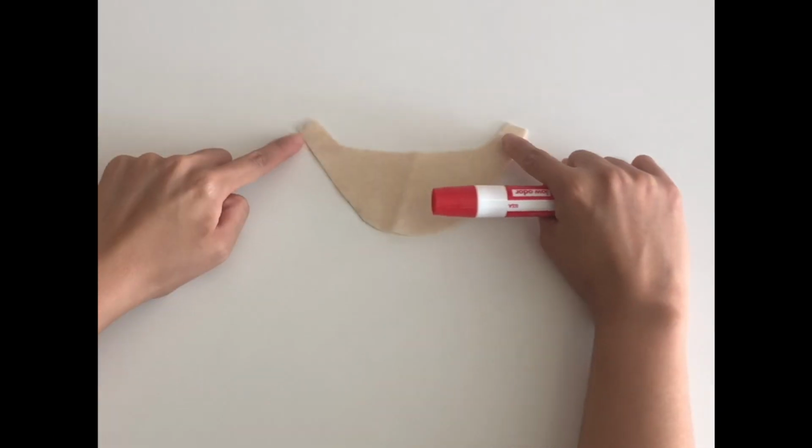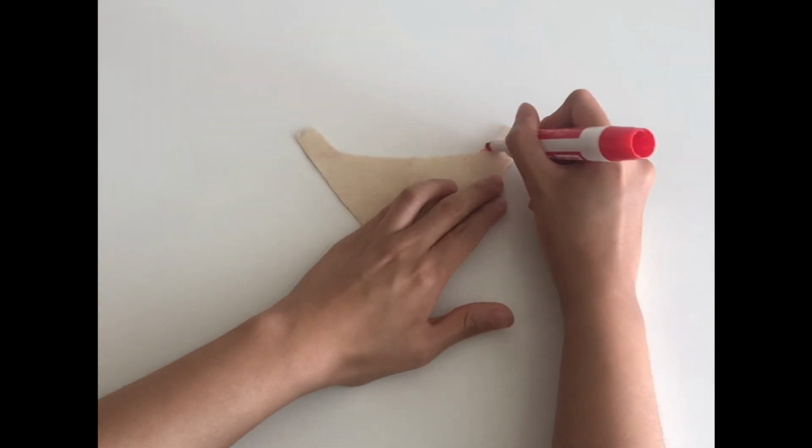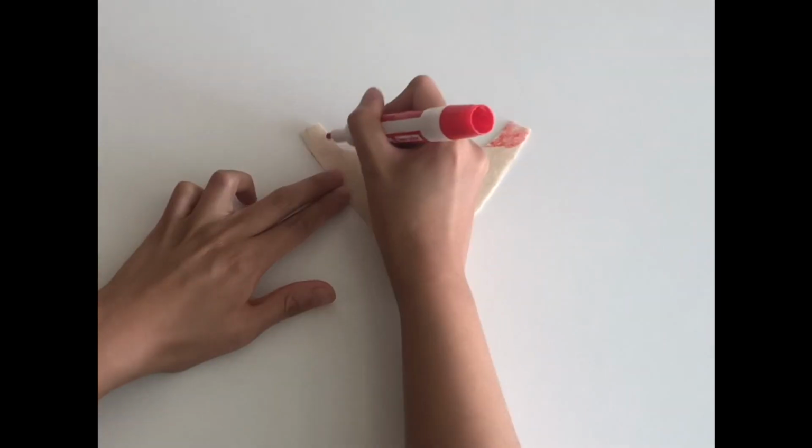For the bladder shape, color in the extensions with red marker to represent the round ligaments.